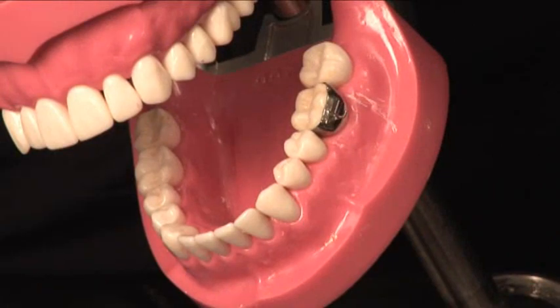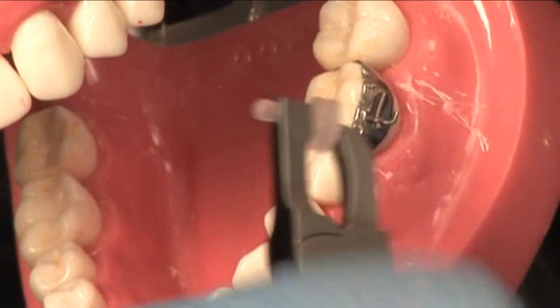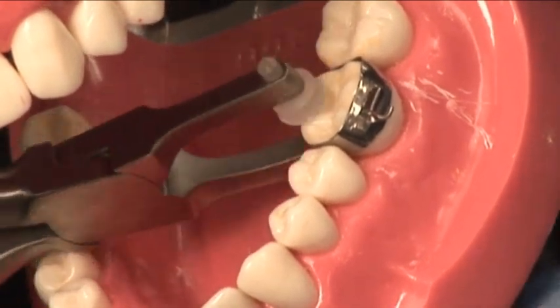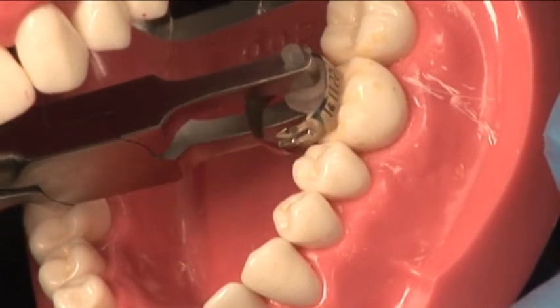Okay? Then when we take the band off, using a posterior band remover, you're going to grab the band, and again, I apologize, use the tooth as a leverage point on the inside, and be able to take the band off between the contact.